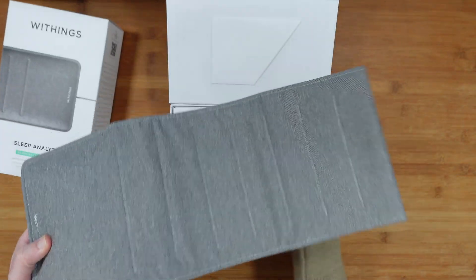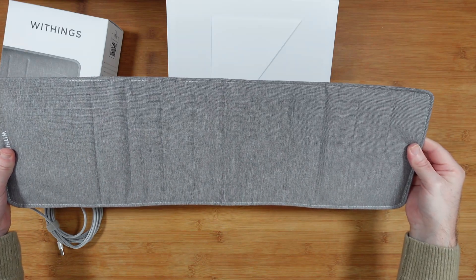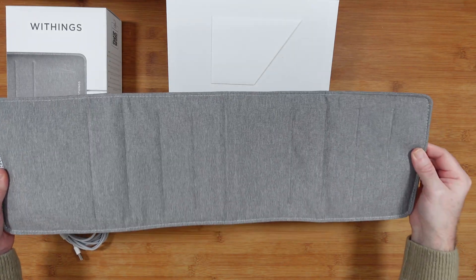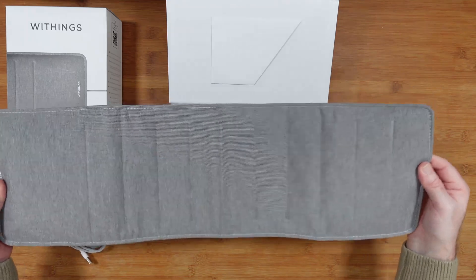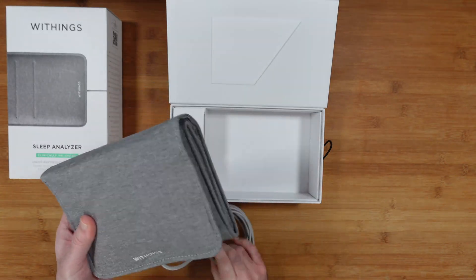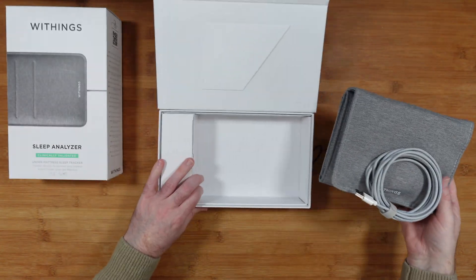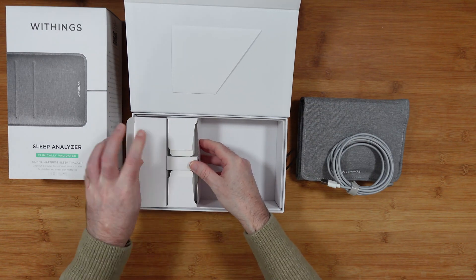Here's the product itself, really nicely presented. It looks like it connects via USB. Let me unravel it — that's fairly big, around 60 centimeters. You place this underneath your mattress, and if you've got a double bed and you're sharing with a partner, you could get one each so there's room for one on either side, giving you different readings. There's also a very nice long braided cable, which seems really good quality.